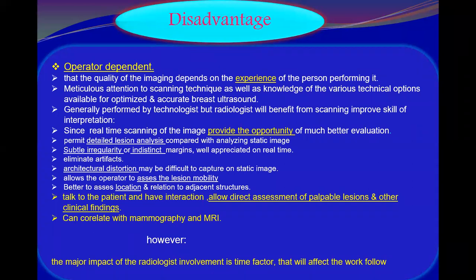Also, it will allow the operator to assess lesion mobility and to make sure you are scanning the clinical concern, targeting the patient's concerning lesions. Because it is an interactive process, you can better assess the location of the lesion by yourself and the relation of the lesion to the other structures. You will see how far the lesion is from the nipple, and how the lesion reaches the pectoralis muscle or the chest wall while you are scanning.